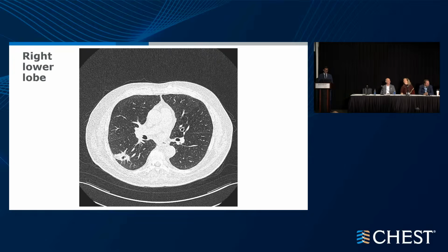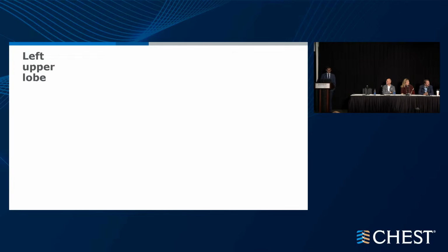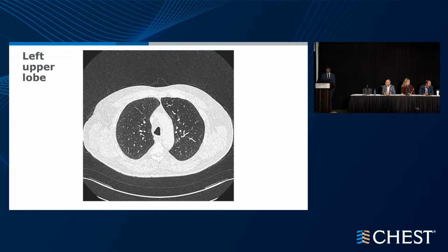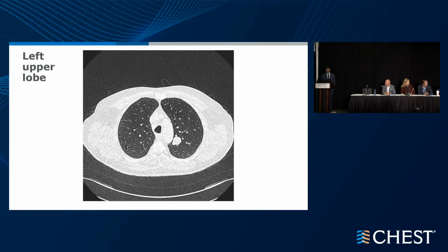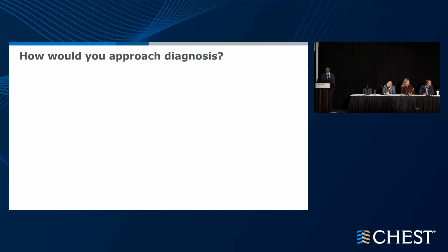I'm going to go back down one more time, just scrolling through. And then this is the left upper lobe lesion that was seen in it. So, I'll go back. Okay. One more time. All right.